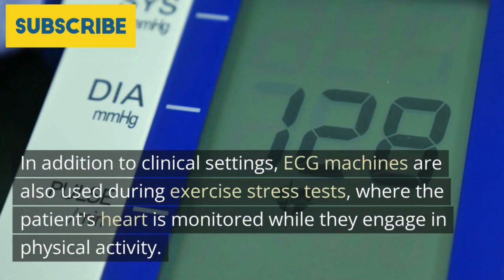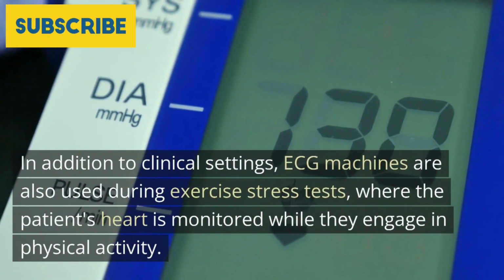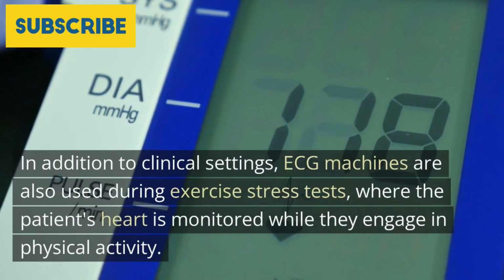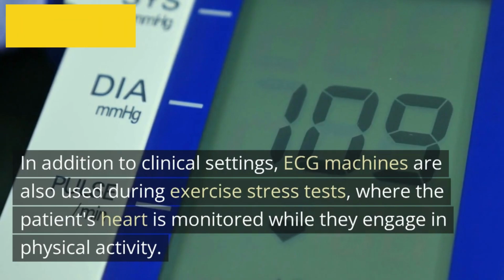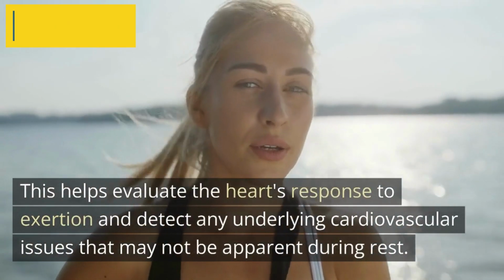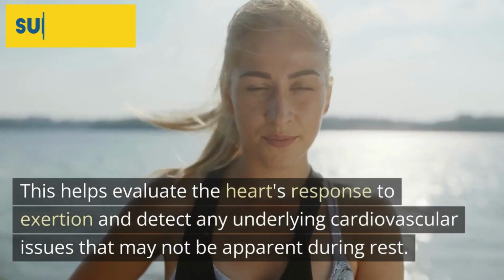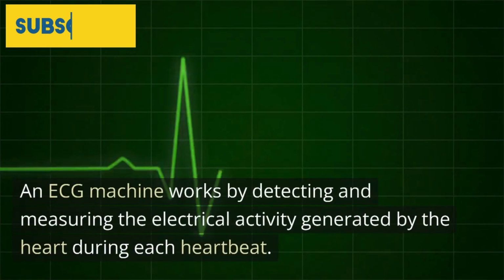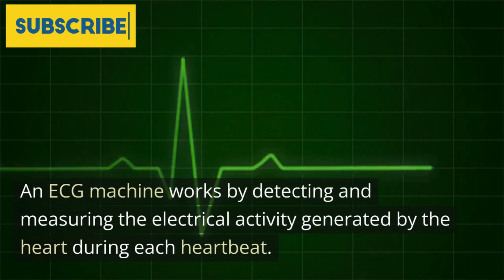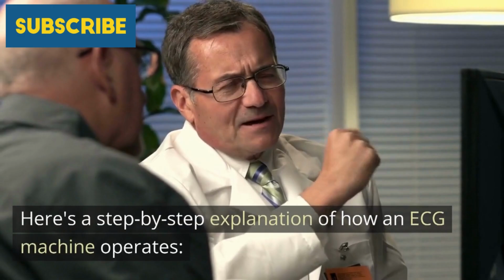In addition to clinical settings, ECG machines are also used during exercise stress tests, where the patient's heart is monitored while they engage in physical activity. This helps evaluate the heart's response to exertion and detect any underlying cardiovascular issues that may not be apparent during rest. An ECG machine works by detecting and measuring the electrical activity generated by the heart during each heartbeat. Here's a step-by-step explanation of how an ECG machine operates.